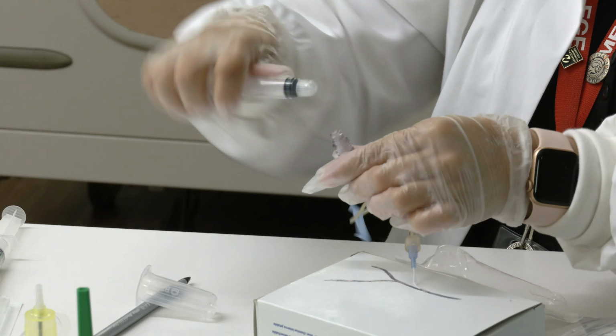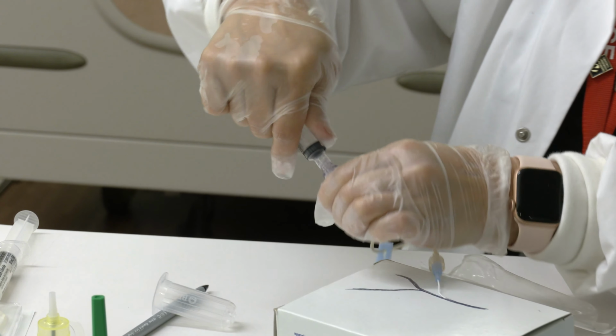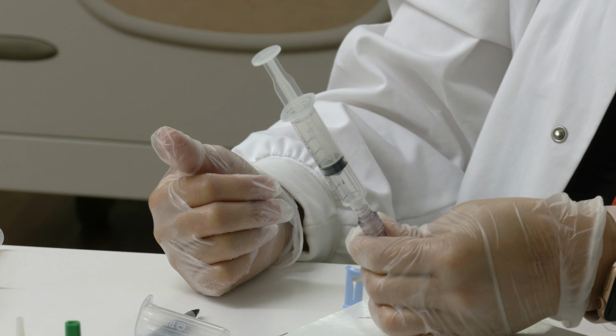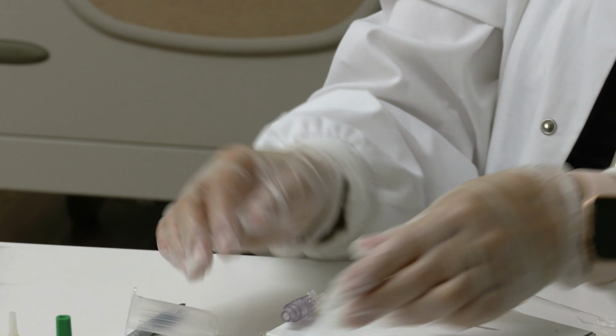We're going to wash this off. Go straight from that piece. And then you'll be able to draw your blood back that way. All right. And that's it.